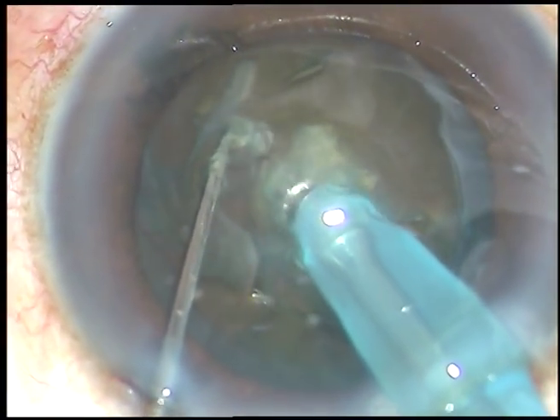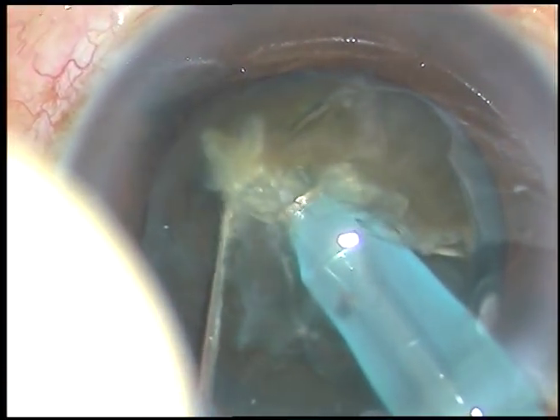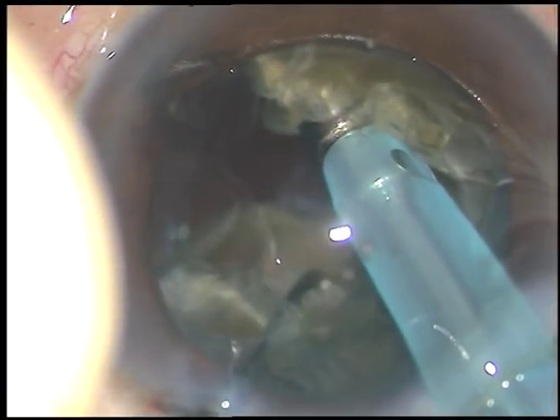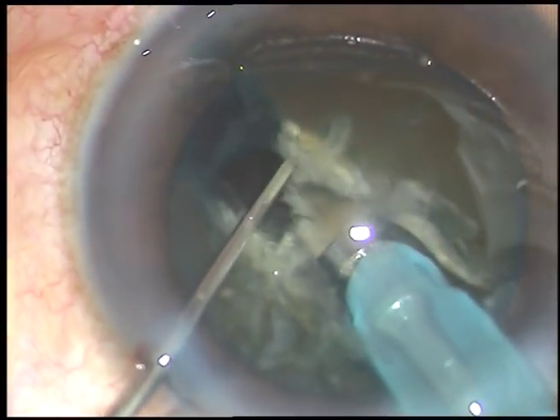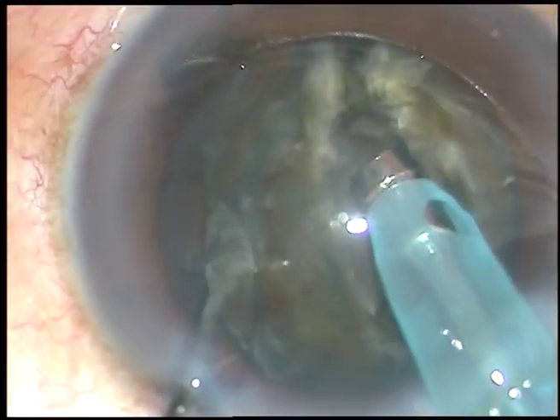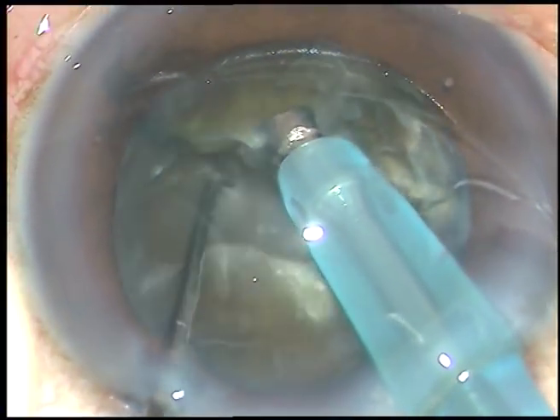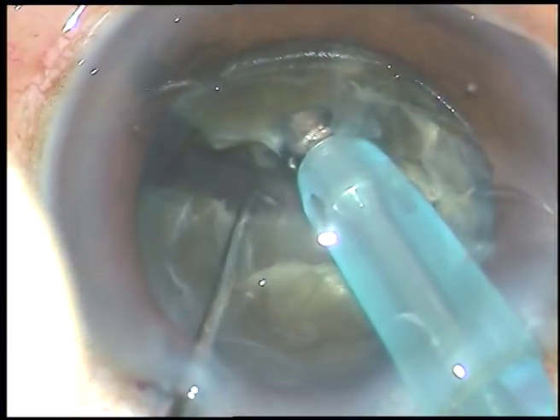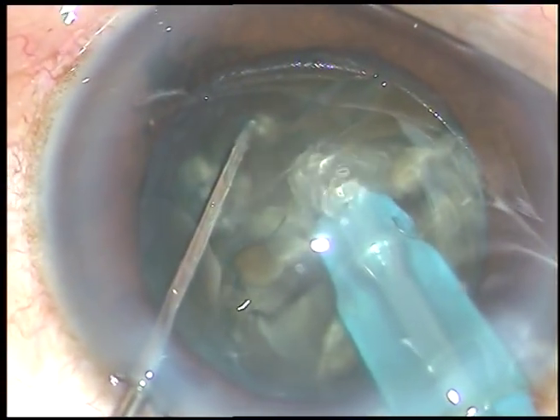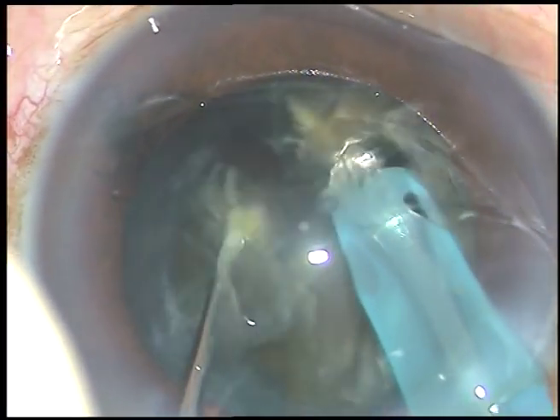The tip travels through the substance of the nucleus like a submarine, crosses the center, goes towards the opposite equator. The chopper supports the anterior surface of the cataract and chops the nucleus. Rotate it 180 degrees. Hold the piece which is inferior and separate the pieces completely. And thus, you have made two completely separated hemi-nuclei.